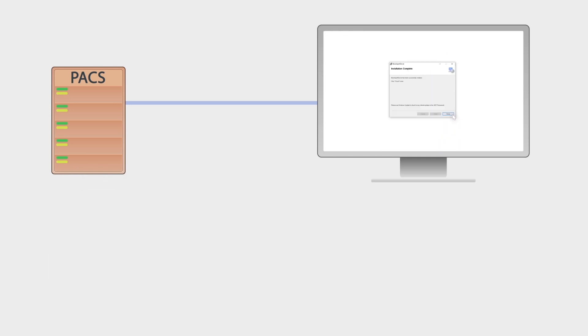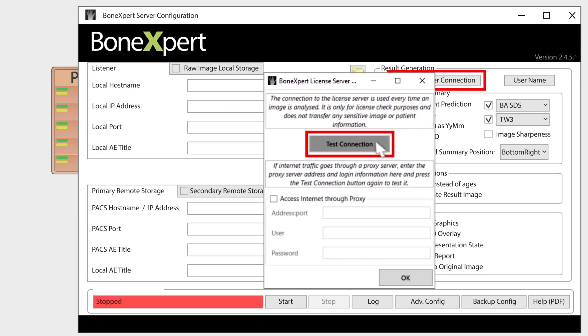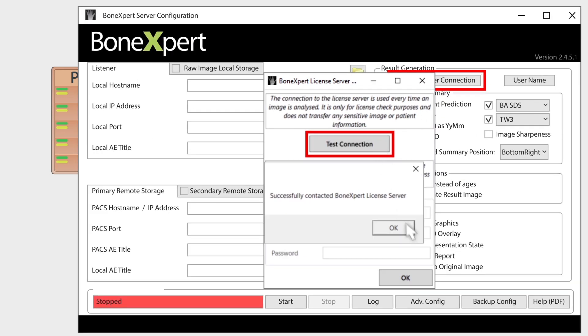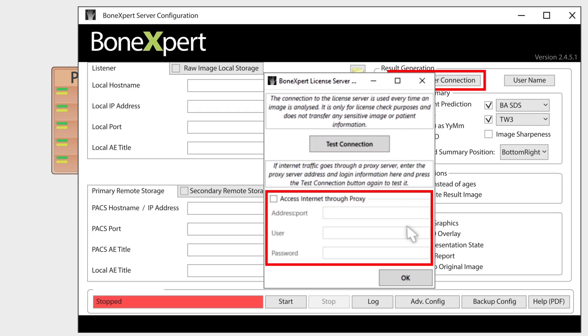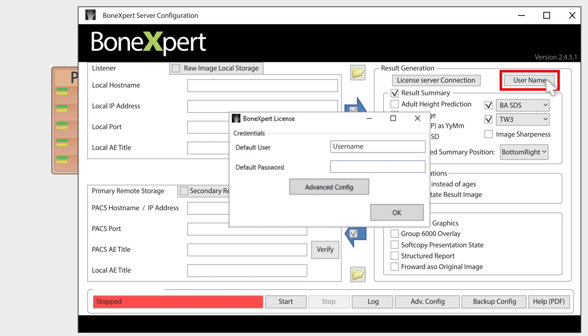After downloading the software, you first check the connection to the license server. Optionally, you can configure your proxy server. Then enter your username and password.